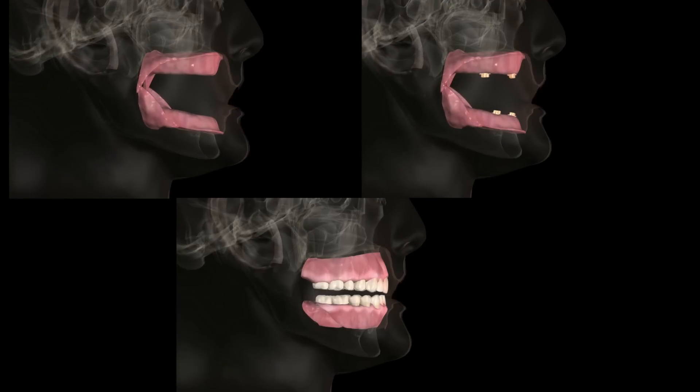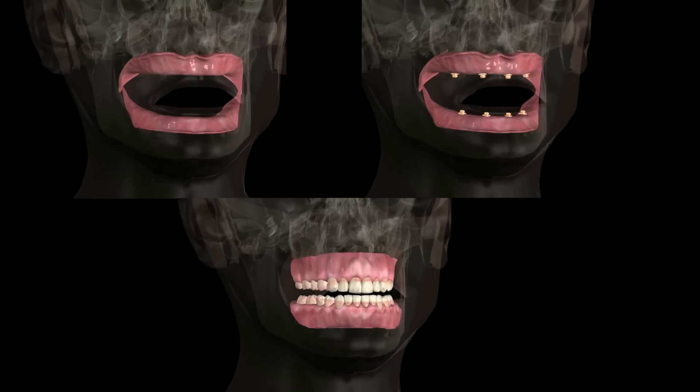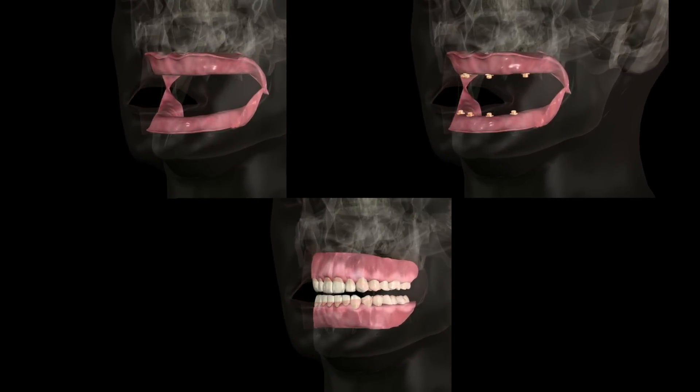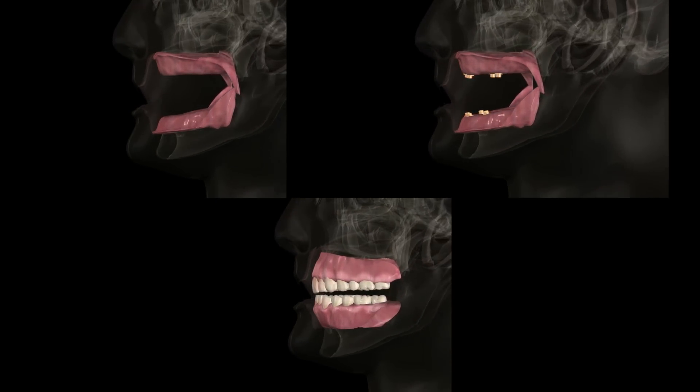When constructing any type of prosthesis, it's imperative that the dentist know the position of the lip when the patient is relaxed and smiling in order to determine the height of the prosthetic components, both implants and teeth, a critical step in achieving a natural-looking smile.